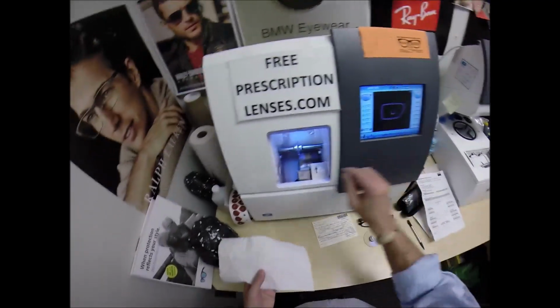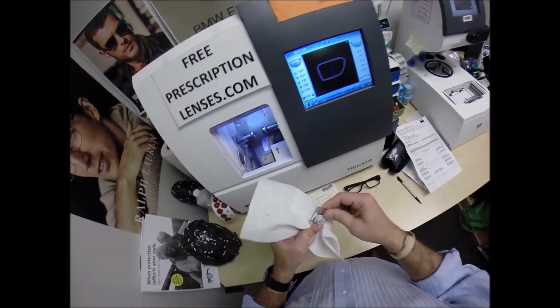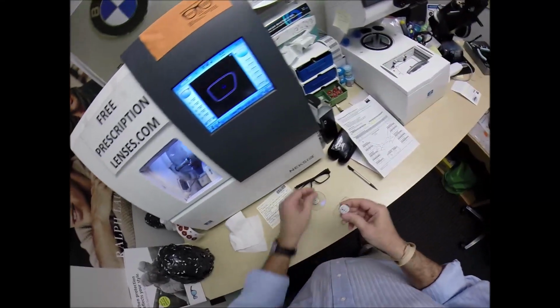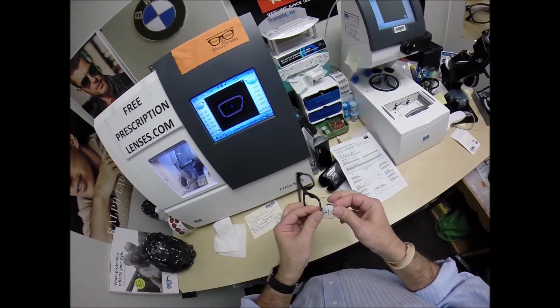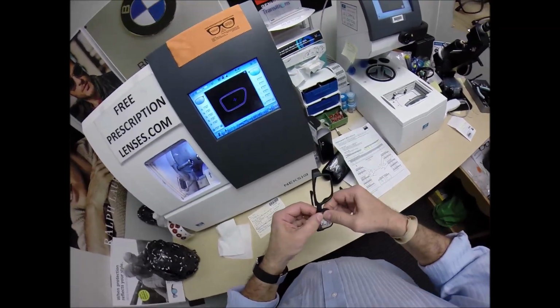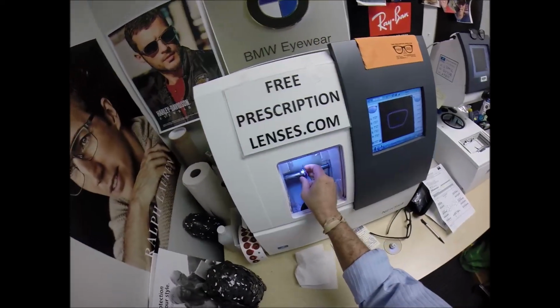I'm going to take the lens out of the chuck. Dry everything off. We're going to mount the lens, see if it fits first time around. If not, I'll take it down some more. I'm going to tuck the lens in at the outside corner. I go to press down the nose. It does not want to go back in easily, so I'm going to take another 1/10 of a millimeter off.